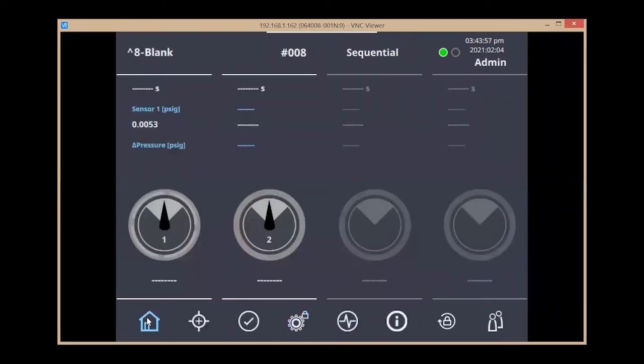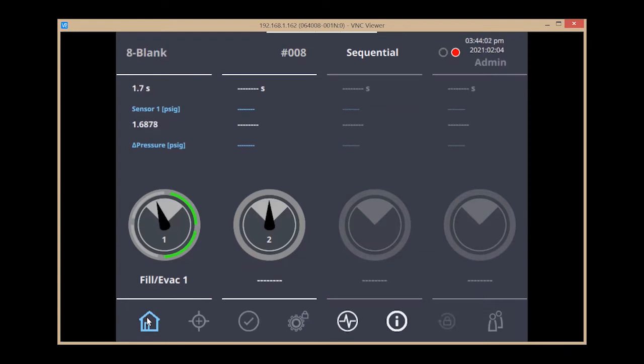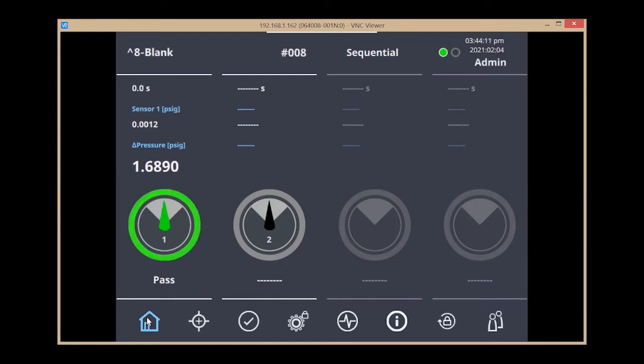Going back to my home screen, I'm going to start the test. The system will fill for five seconds to the limit of two psi and then move on to the measurement step, vent, and then report the results. Here my valve is open, so my pressure drop in the measurement step was 1.689 psi, which is greater than the one limit, resulting in the green or the pass for this part.